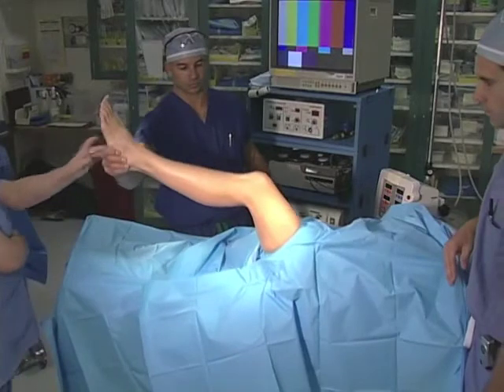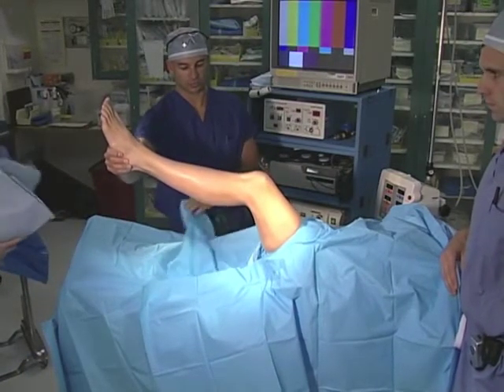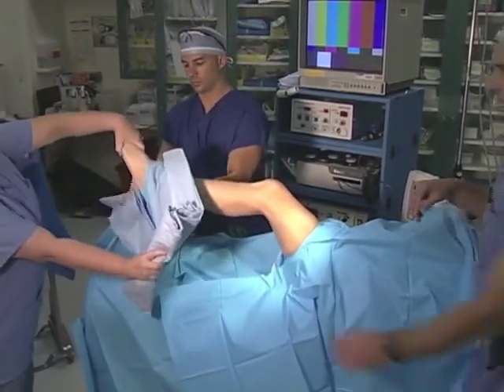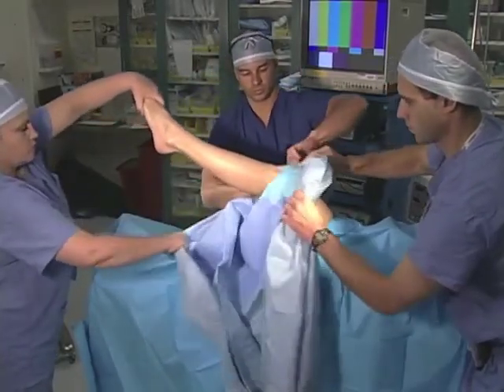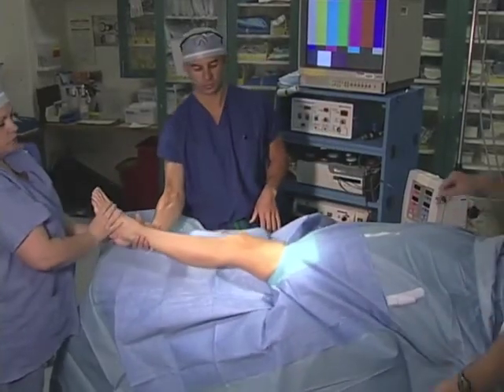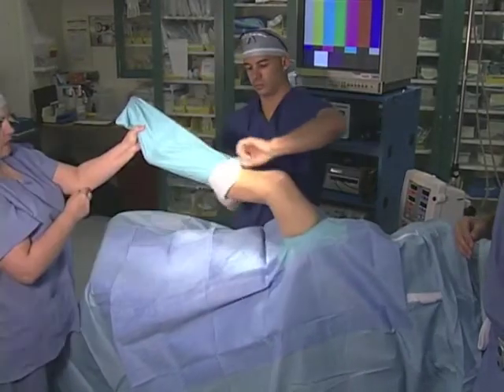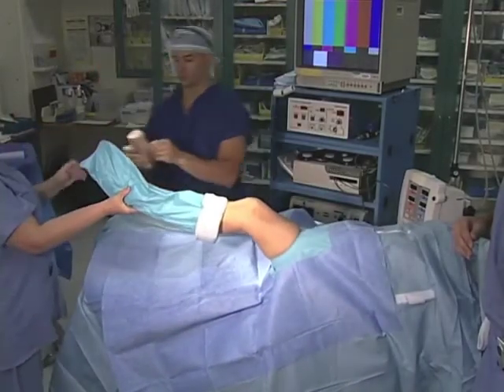An arthroscopy drape is positioned over the foot. These generally have a hole or diaphragm which seals the arthroscopic fluid and prevents it from leaking up under the tourniquet or off of the arthroscopic field. As an option, an impermeable stockinette may be placed over the foot to seal it off from the arthroscopic field. The stockinette may be held in position with co-band tape, which sticks to itself and holds it in place.